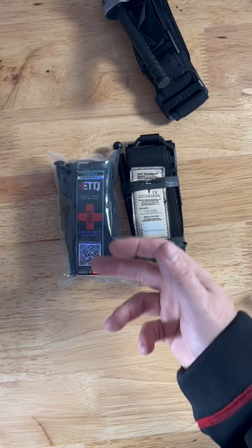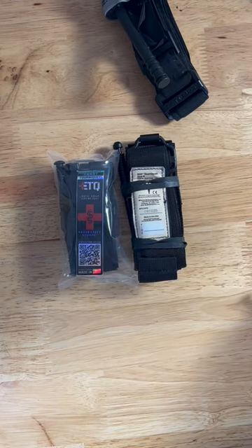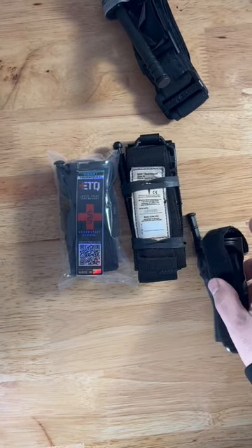It comes with nice instructions on how to actually use the tourniquet. You can scan a barcode if you want to leave that on there and you don't have training on how to use a tourniquet. But really lightweight and easy to carry in your EDC.